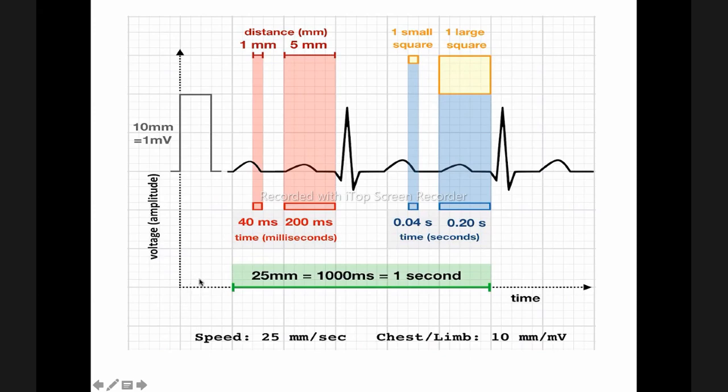So even when you're memorizing that, the PR interval, from the beginning of P to the beginning of R, should not exceed 0.2. It's between 0.12 and 0.2 seconds. Then what you're saying is that it shouldn't exceed 5 small boxes, because 5 times 0.04, which is one big box, will give you 0.2. Or the QRS should not be more than 0.1 or 0.08 seconds. So it means that it should not be broader than 2 small boxes. That's what you're saying. Have I lost you there?